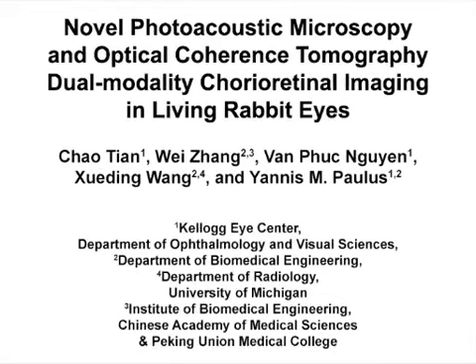The overall goal of this novel imaging setup and operating procedure is to perform photoacoustic microscopy and optical coherence tomography dual modality for non-invasive, label-free, chorioretinal imaging of the eyes of larger mammals, such as rabbits.